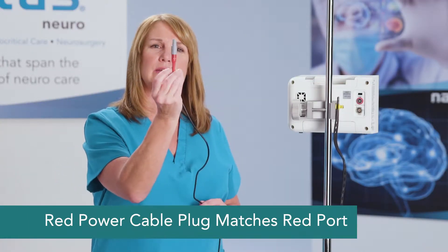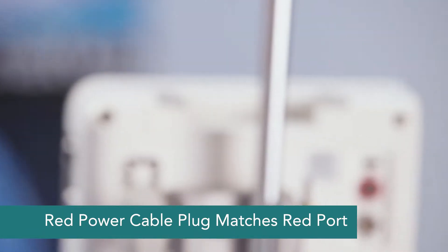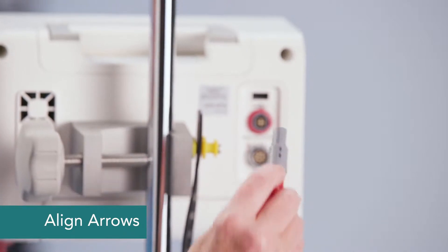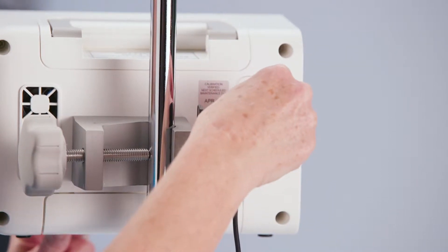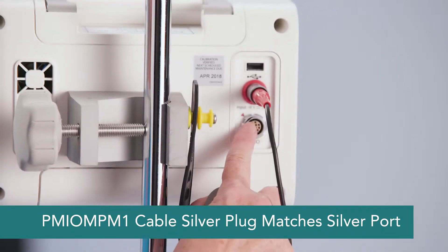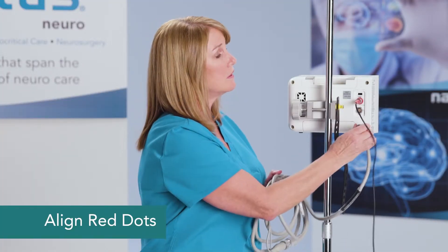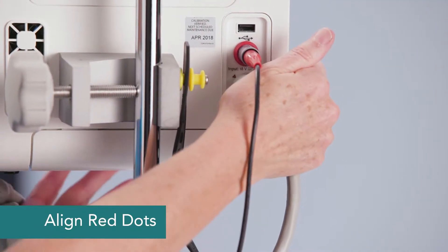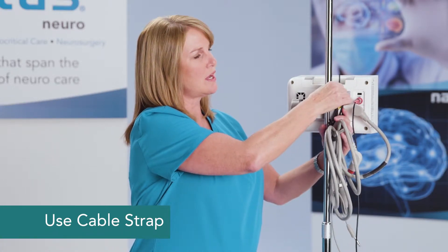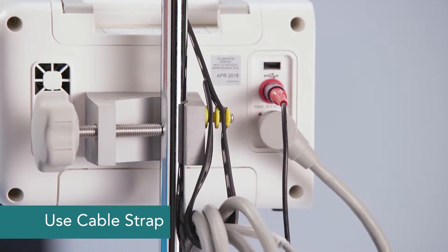Let me show you the back of the machine. The power cable has a red coloring on it and that plugs into the red port — line the arrows up and just push. Everything is push-pull with connection to the Camino. The gray cable has a silver connector and plugs into the silver port. Line the red dot on the connector up with the red dot on the port and just push them in together. To keep these cables organized, we can use the strap on the back of the monitor and click it into place.